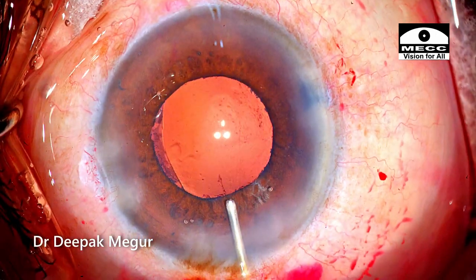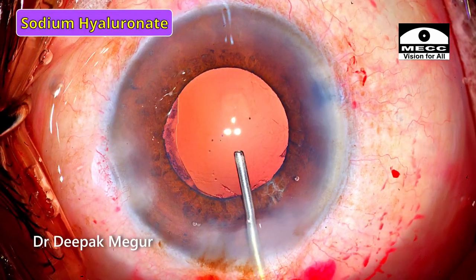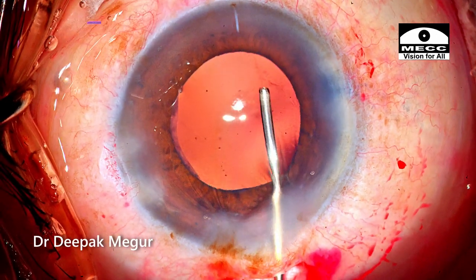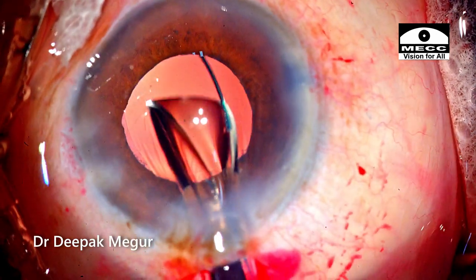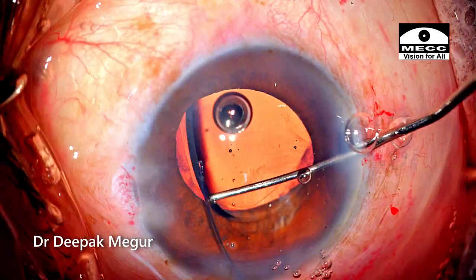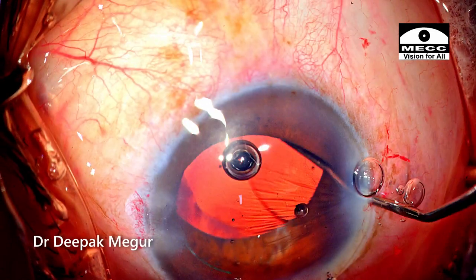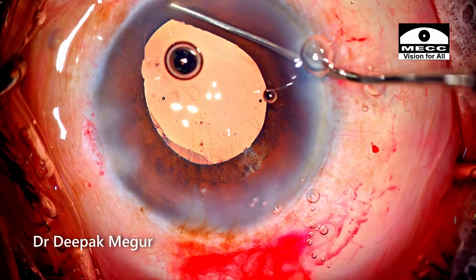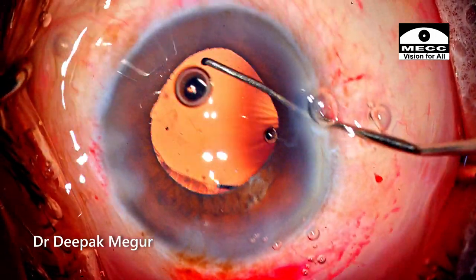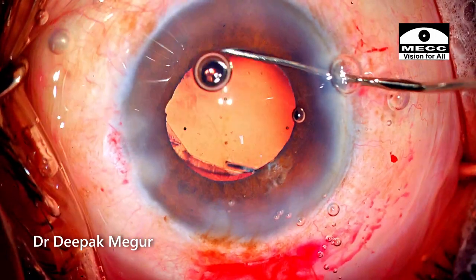Time to implant the lens. I'm using sodium hyaluronate to form the bag, and this helps especially when you're using a multi-piece hydrophobic IOL, and that is the lens which I'm going to use in this case. The lens is implanted into the bag, but I notice that the haptic is sitting in the area of the incomplete rhexis. I need to manipulate it.